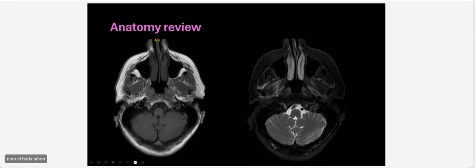Okay, and also I want to ask someone else. What do you think about this, or this, and this very dark circle here? Vessels. Yes. Some vessel. Yes. Great. Okay, that's good. That means you are still awake. No one sleeps on me during the physics part. Yeah, that's very important. See, it is a flow void, right? So it's healthy. It's a flow void.